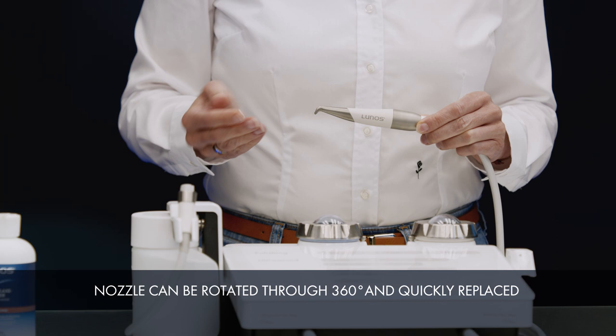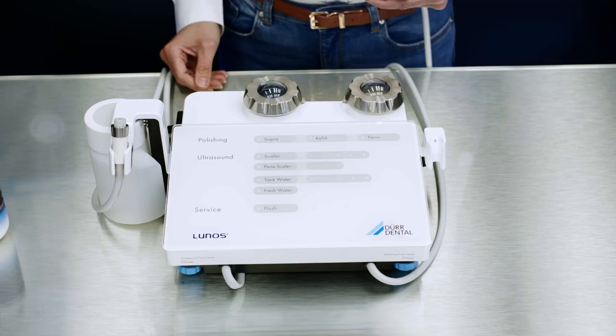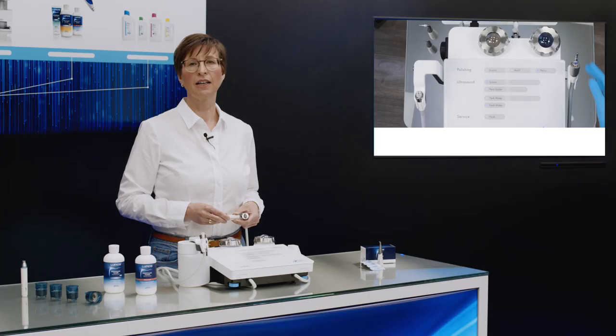The nozzles can also be replaced quickly and easily if necessary. This, together with the supra and perio functions that can be selected on the device display, enable the user to quickly switch between supragingival and subgingival application.